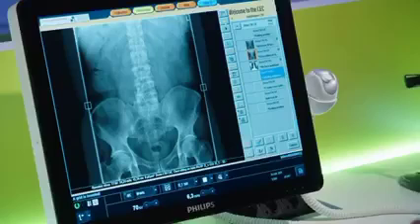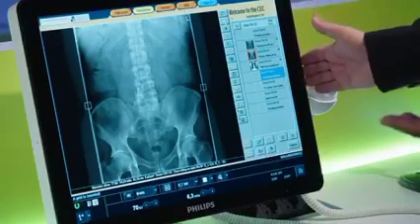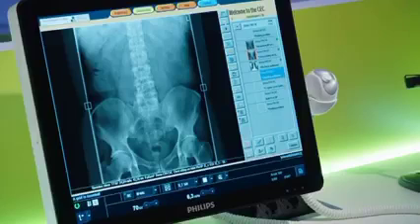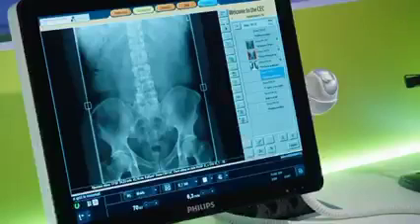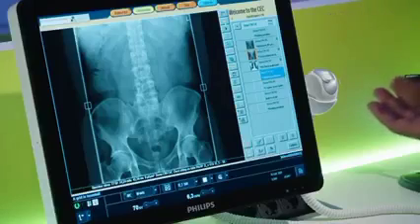Next to this, the displays that we are using are medical grade monitors, so they also build more confidence inside your examination room and not only on your PACS monitors. All in all, the Digital Diagnost C90, in the many versions that we can offer, is all built on great components like the Eleva tube head, the live camera, the Eleva platform, and the motorization offering that we will have, making this room into the ideal room for high volumes, optimal patient care, but also, of course, the best image quality possible.